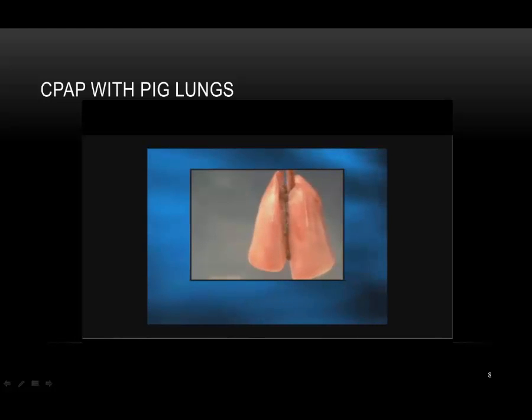After we eliminate CPAP, you can see the lungs almost immediately begin to collapse. Then, with each breath, there remains significant atelectasis. This is why leaks and loss of CPAP are detrimental to the patient. What we strive for is consistent CPAP and therefore continuous progressive recruitment of alveoli.